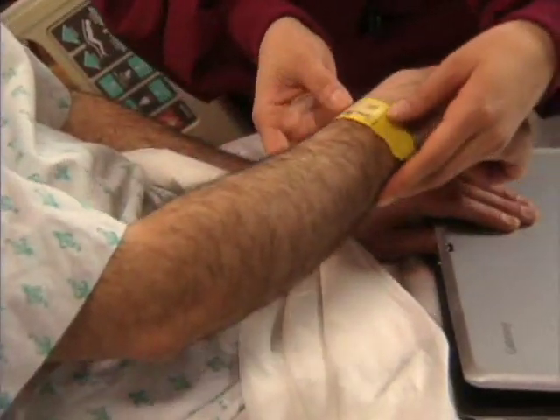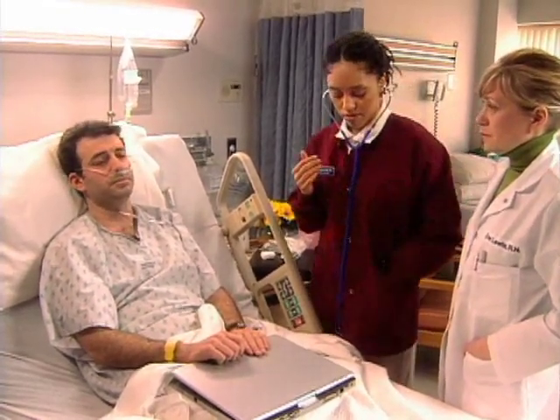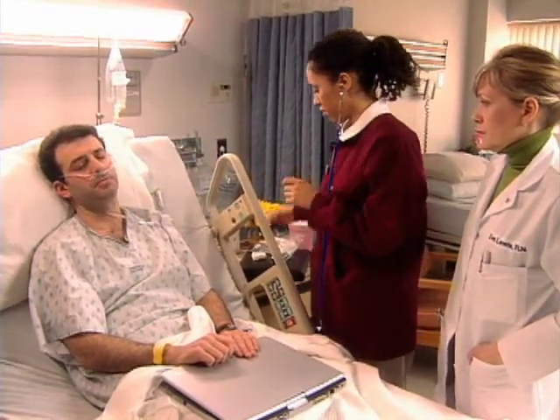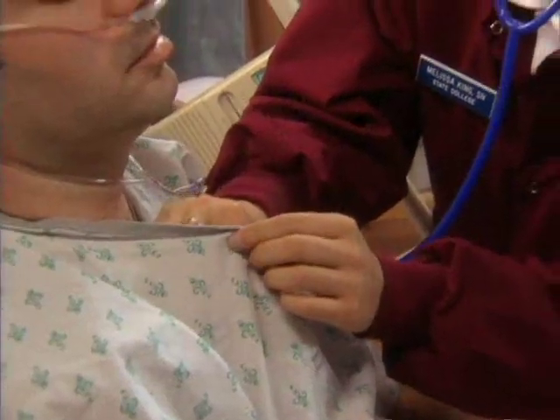Okay. I'm going to check your ID band. Can you tell me your name? Robert Simon. Okay. I'm going to listen to your chest. Is that okay? Just take some deep breaths, if you can.